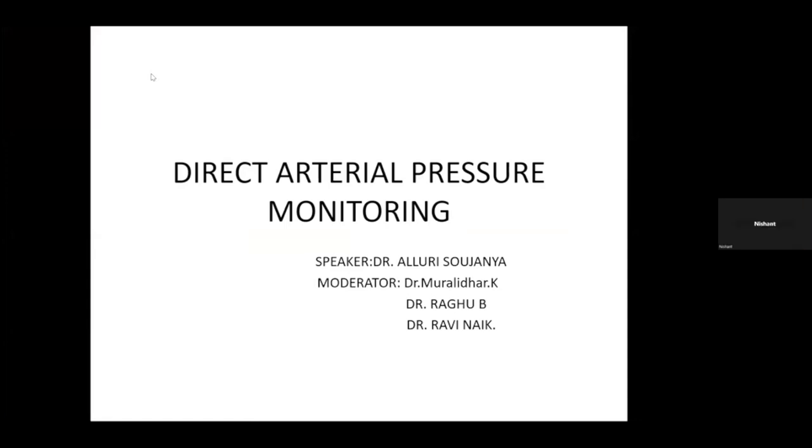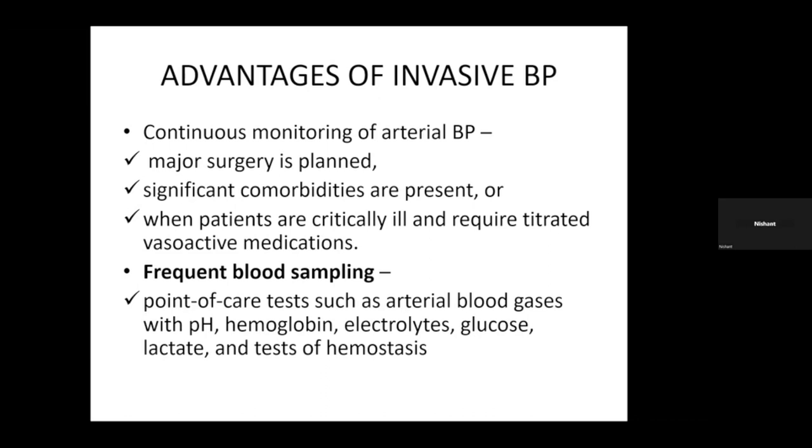Good evening, everyone, sir. Sir, am I audible? Yeah. Okay, sir. Good evening, everyone. Today I'm dealing with the topic of direct arterial pressure monitoring. This was first measured invasively in 1733, sir. From that period, it is undergoing so many modifications to make it more reliable and more feasible.